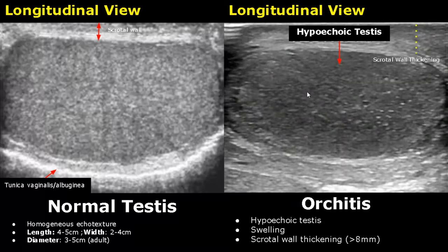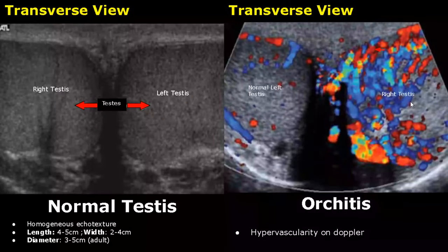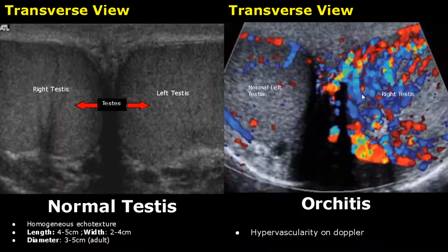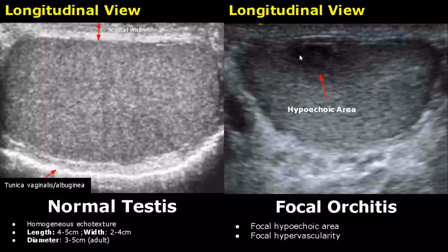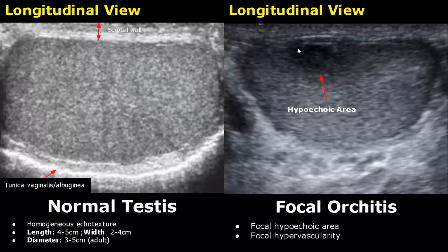Orchitis is the inflammation of the testis. The testis will be hypoechoic and swollen, and scrotal wall thickening will also be seen. On color Doppler, hypervascularity will be seen in the inflamed testis with a large amount of blood flow in the affected testis. A focal abscess can also occur, presenting as a focal hypoechoic and hypervascular area.